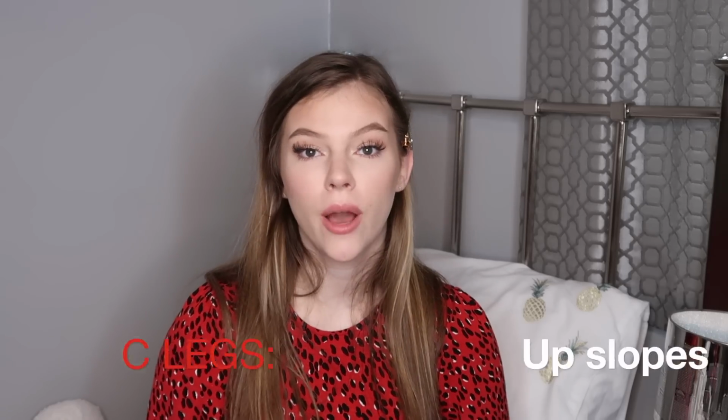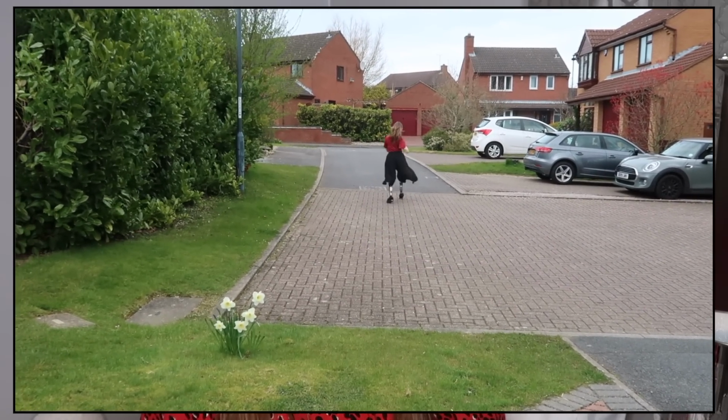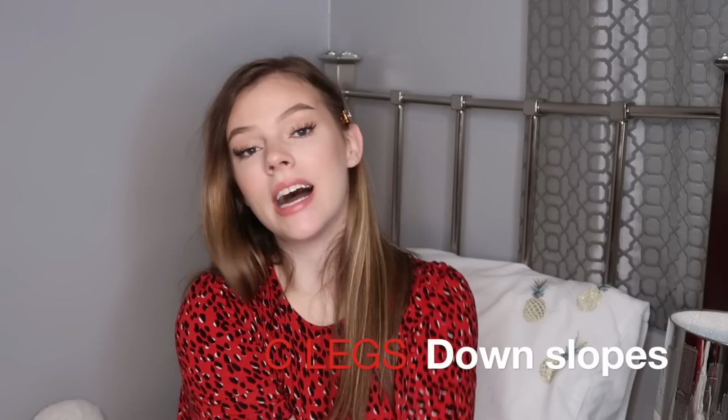This one is slopes going up. Slopes going up was never an issue for me. It was just like walking, really. Yeah, it's a hill. It's sometimes difficult, but it's fine. It's not really a problem. So that's just something that I walk normally. Is it more difficult? Yeah, it's a hill, but not scary difficult. So that is going up a hill. I feel like that's just something that came with walking, and was just like, okay, this is what you do. And then the other one I've got here is down slope.